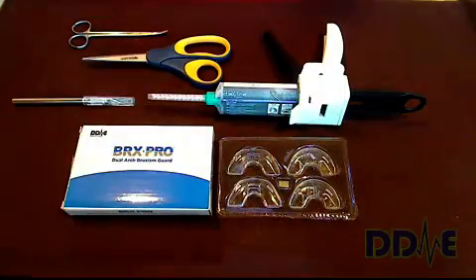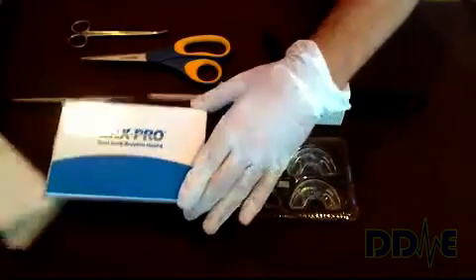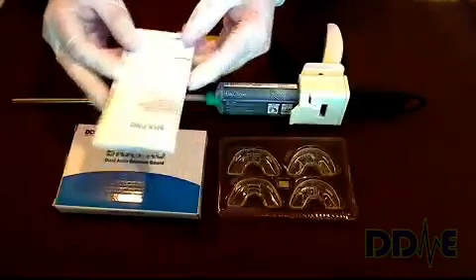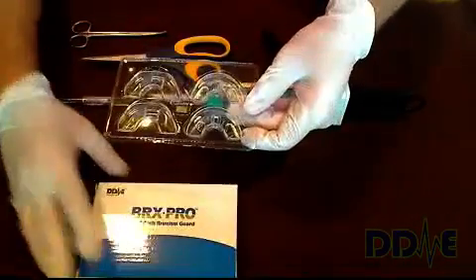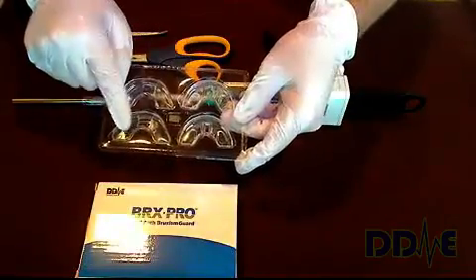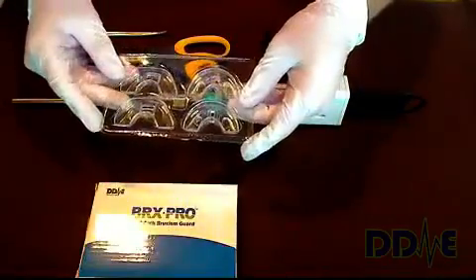So having said that, let's get started. Included in the packaging of the BRX Pro are two sets of instructions — one set for the prescriber and another set for the patient. It's very important that the patient be sent home with the instructions when you make them a BRX Pro. Also in the packaging are several sets of trays: a set of impression trays and a set of therapy trays, and we're going to talk about the function of each as we go through the training session.